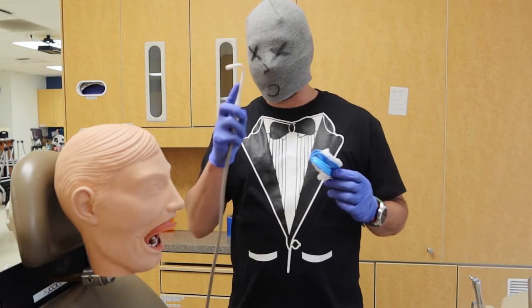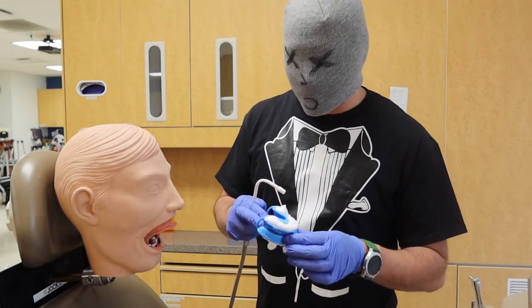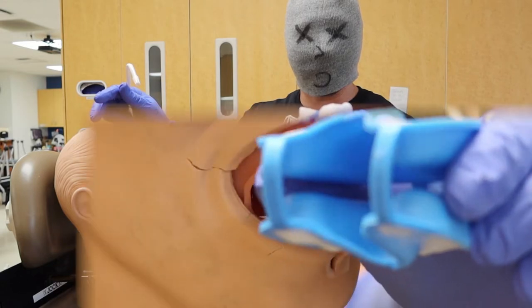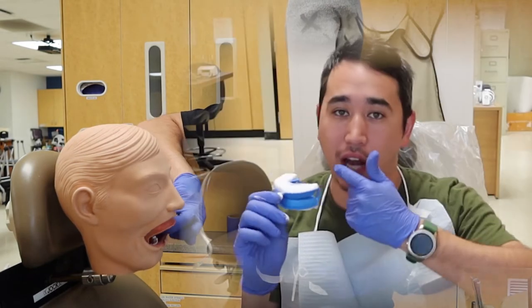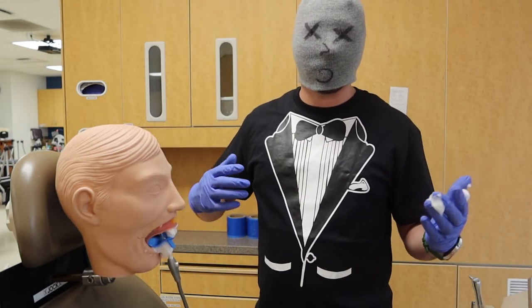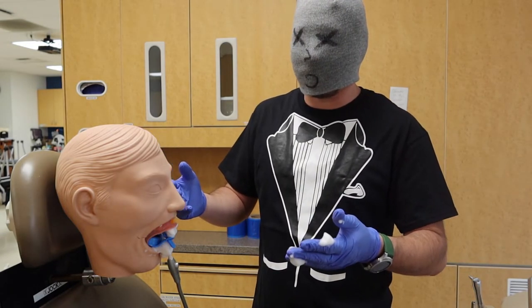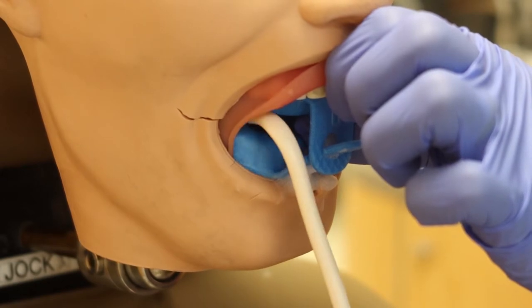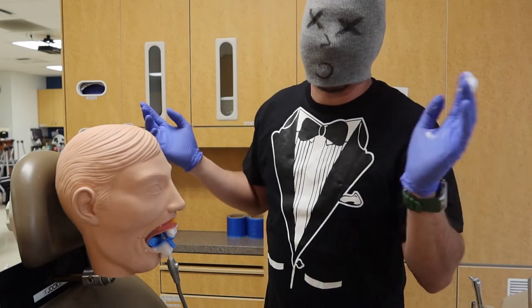Always make sure that you have your saliva ejector right nearby and raring to go. Have your patient open up, and from there we have a couple of techniques for inserting it. We can either pinch it and get it to collapse a little bit so it's easier to insert into the patient's mouth, or we may take it like a tray — like we take an impression — pull one side of the cheek to our direction and rotate it in so that it can fit nice and proper. From here, the patient's going to enjoy the next minute or two. Make sure that you get the saliva ejector squeezed in between those two trays so the patient doesn't swallow any of this.